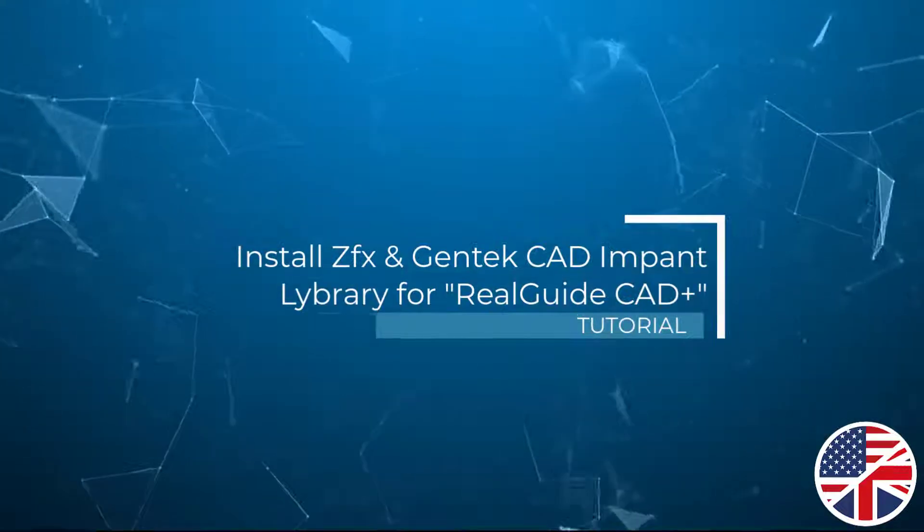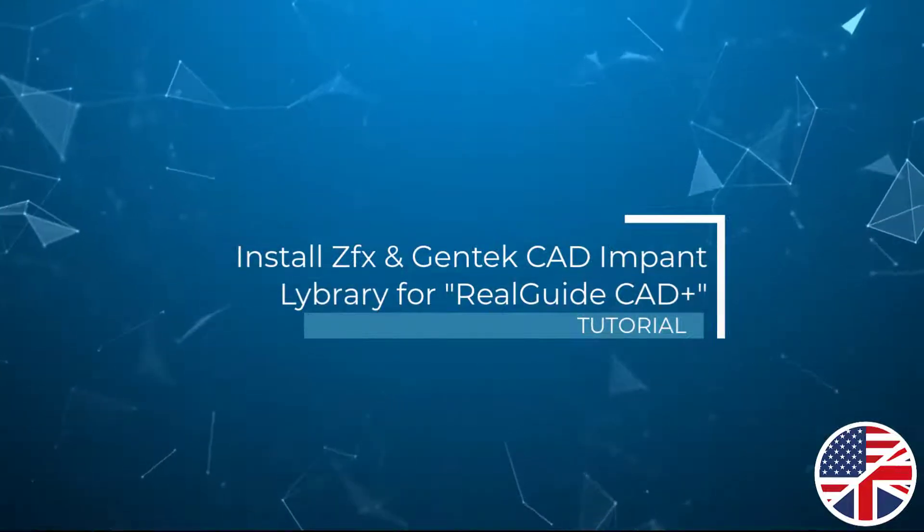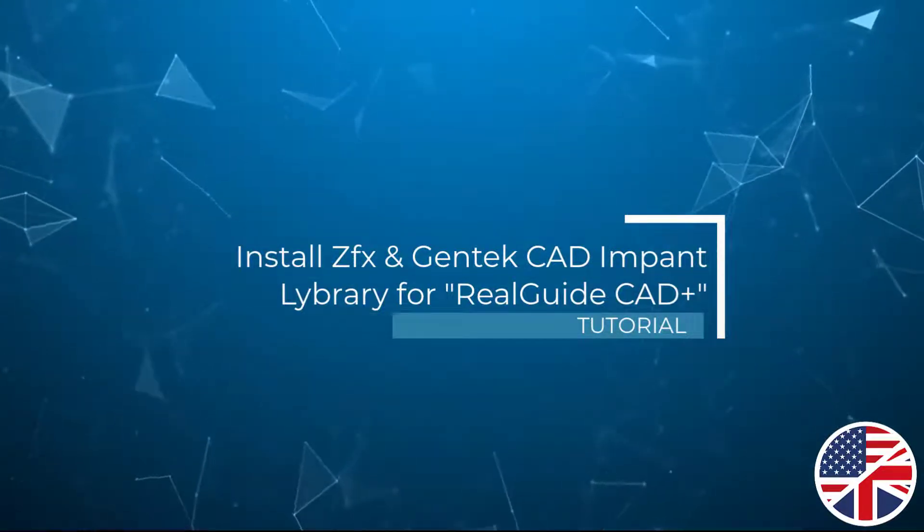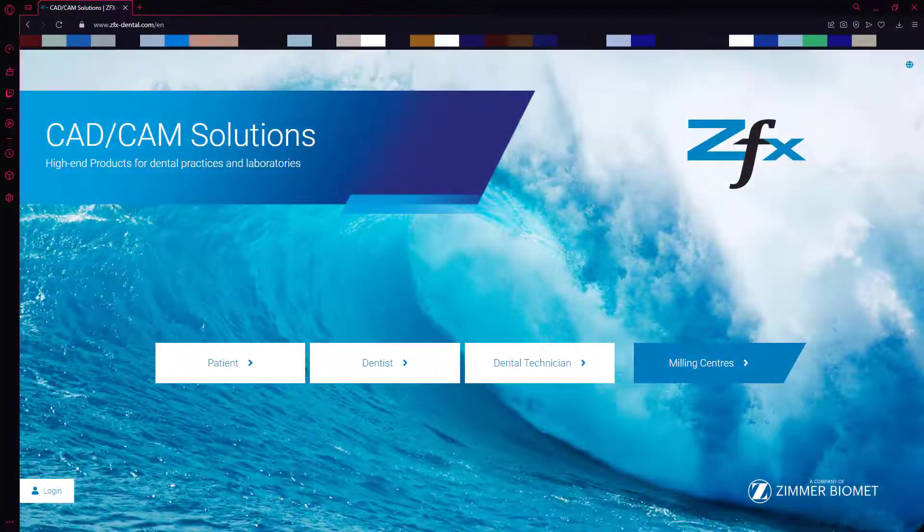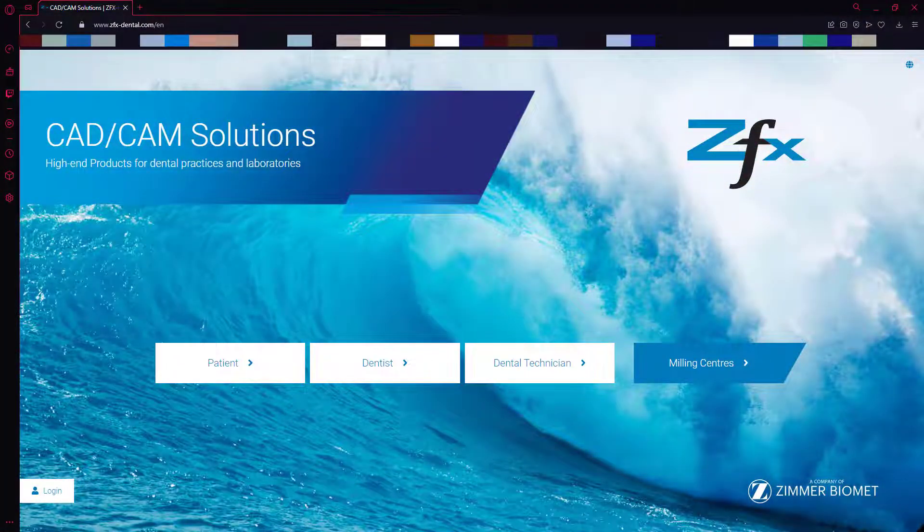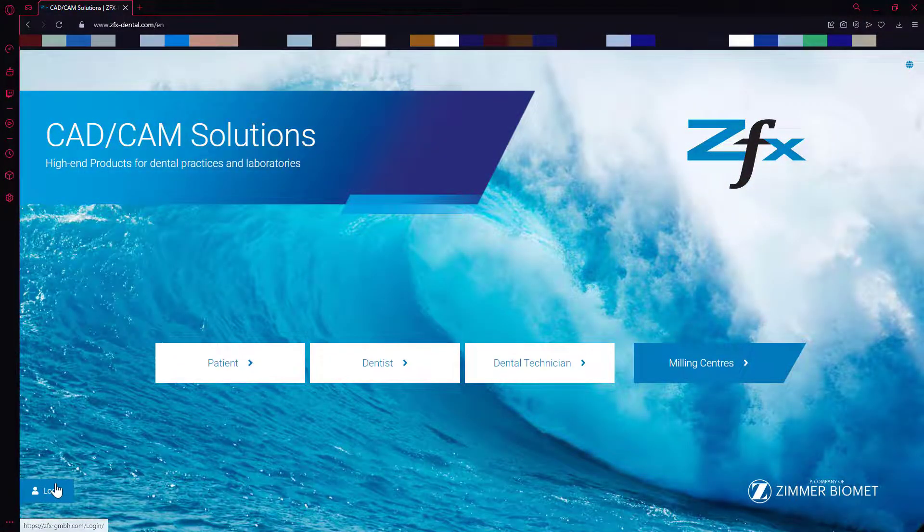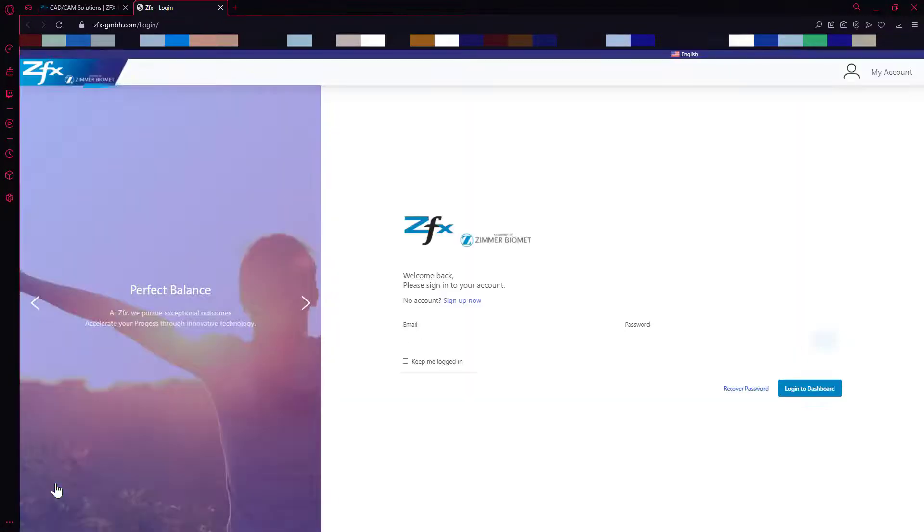Install Zfx and Gentek Implant Library for RealGuide Plus. From the website zfxdental.com, login with your Zfx account.